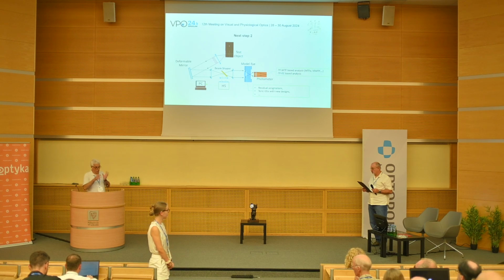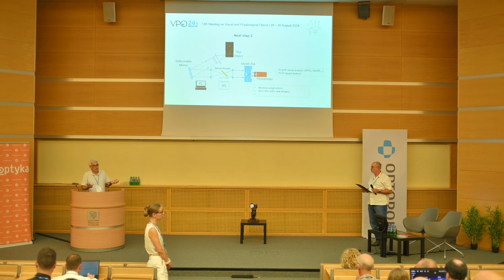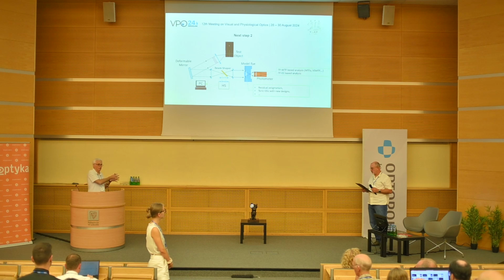MTFA is one of the most usual indicators used by ophthalmologists who use IOLs, but we can also calculate visual Strehl ratio based on MTF and OTF, etc. That is interesting for us, but for ophthalmology it is less used.